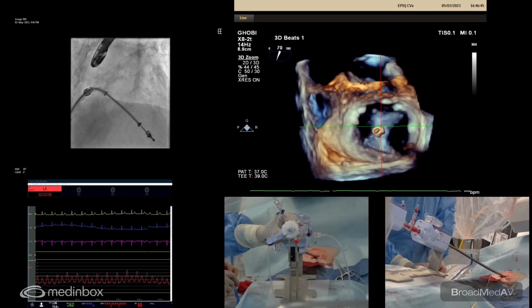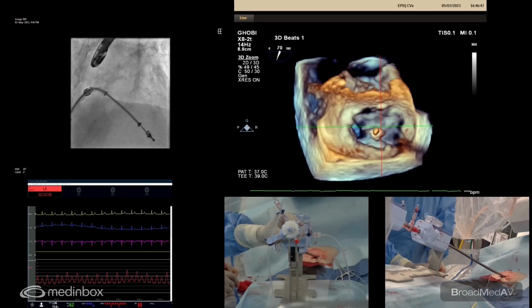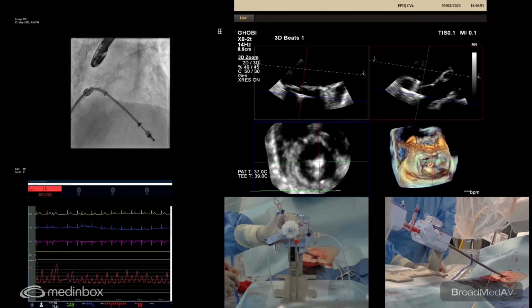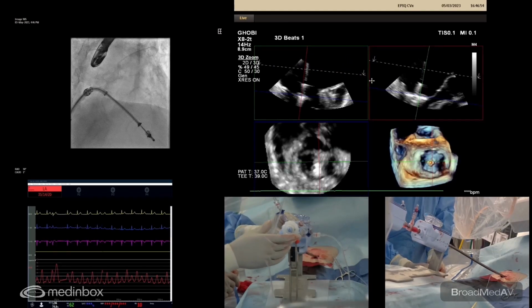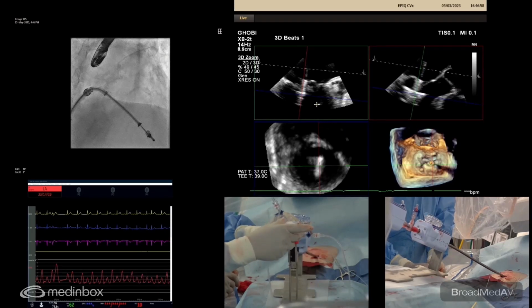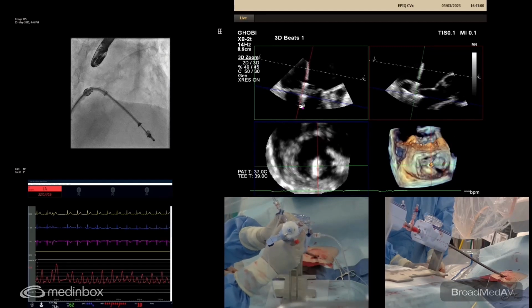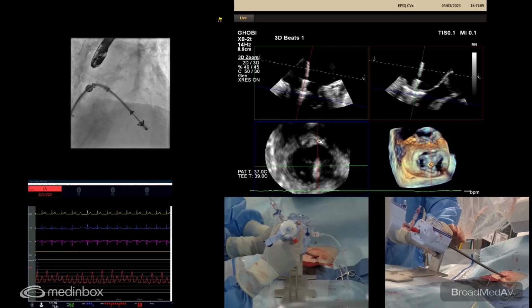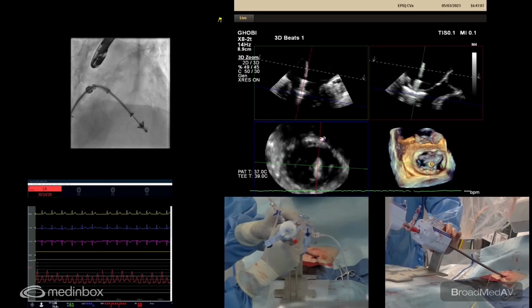Because you'll further lateralize whatever is residual. Okay, so this is good. I agree. All right, so I would like to close the clip here, right? And both resting nicely. Hold it like this. Hold it like that. Good.